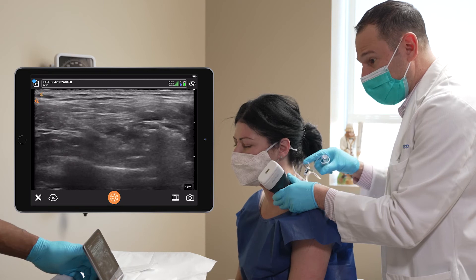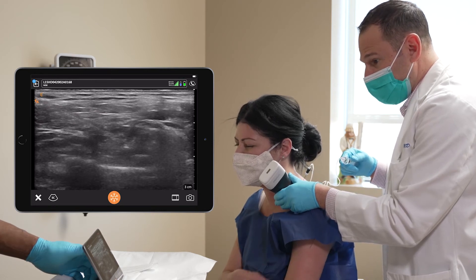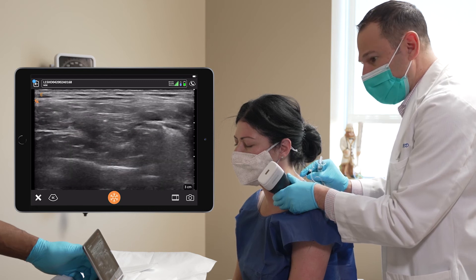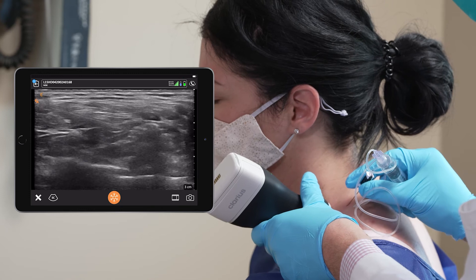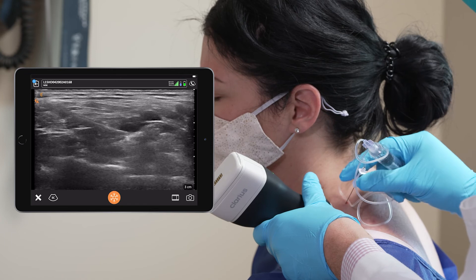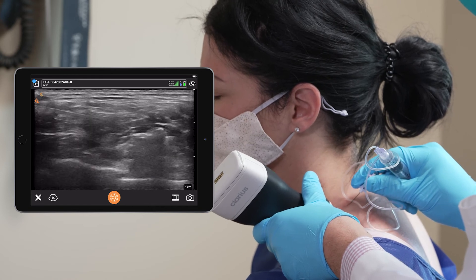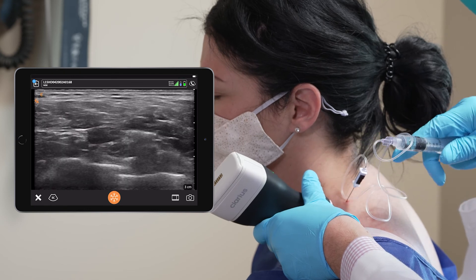I feel like it's going down. Is it where your pain is? No, it's going down at the front — a different spot. So I'm moving the needle away from that. The first position was the best. So let's go where we know is good — covering all sides of the plexus.